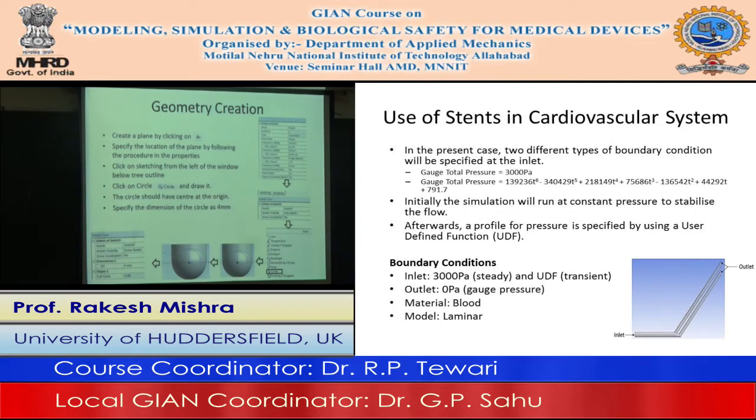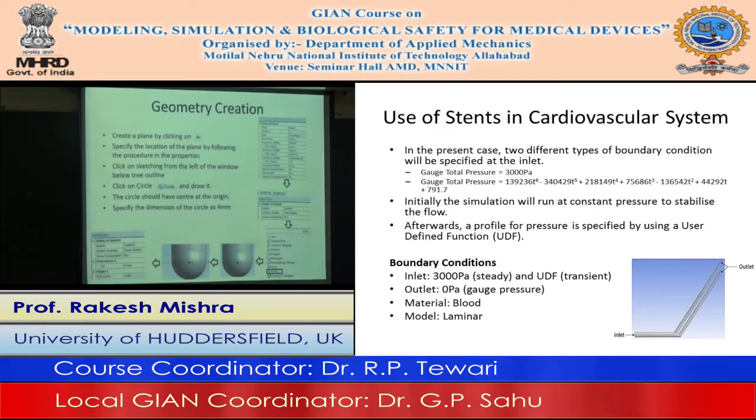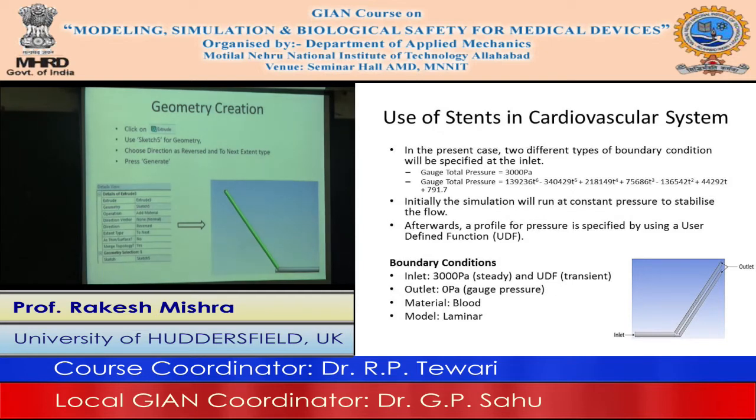Here then we create a plane at 53 degrees and then we draw a circle and extrude it. We get this plane here. So this figure, although it looks that it is directly above it, it is the way it is being viewed. But the main artery is like this. We have plane here and this circle is being drawn here and is coming here, although it looks as if it is on top of it, like this. After this is created, so we created a circle here, extruded in this direction, and the values that are there have been calculated so that it exactly matches that part.